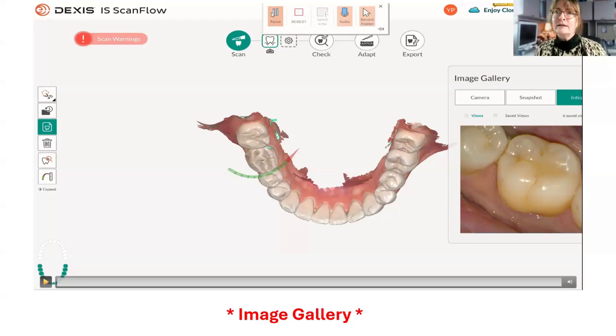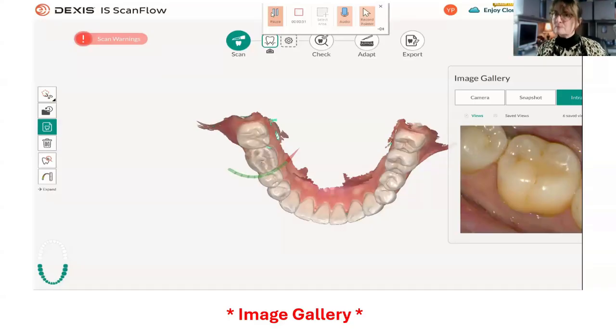He then had his teeth cleaned. The dentist comes in and tells him they're recommending a crown on number 14. They bring up the scan, not x-rays, but they bring up the scan, and they're able to show him his old amalgam filling, his MOD, that has a black line through it that is a fracture and is pushing his tooth apart every time he closes down on it, and recommending the crown to protect his tooth.